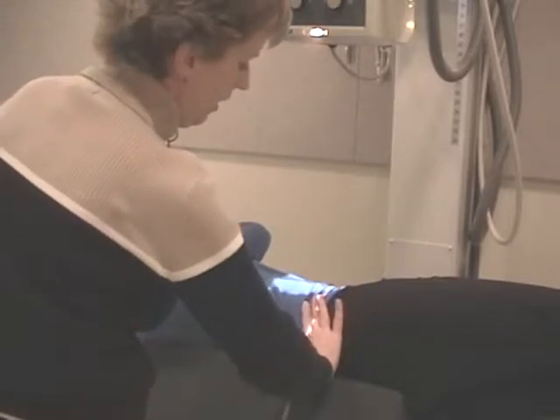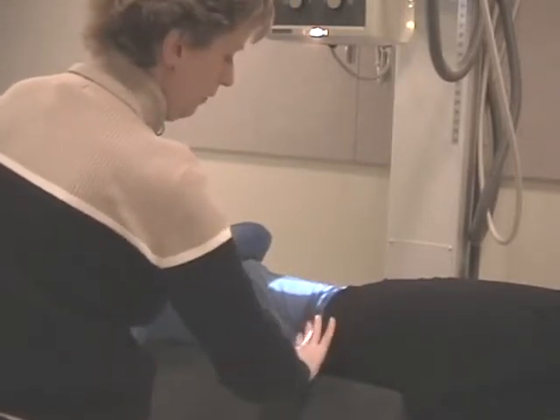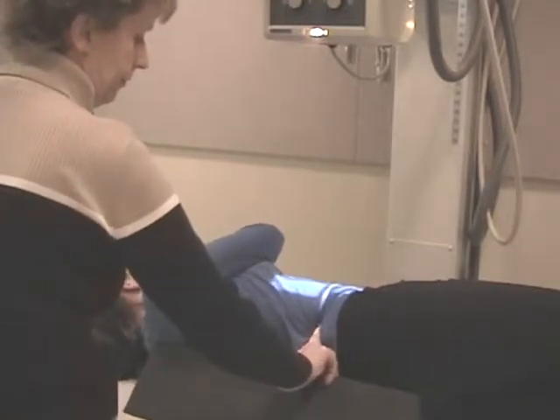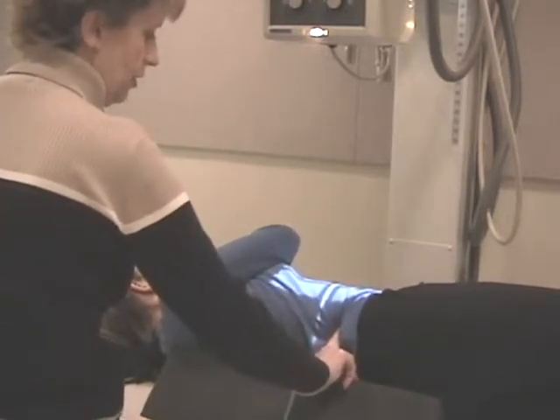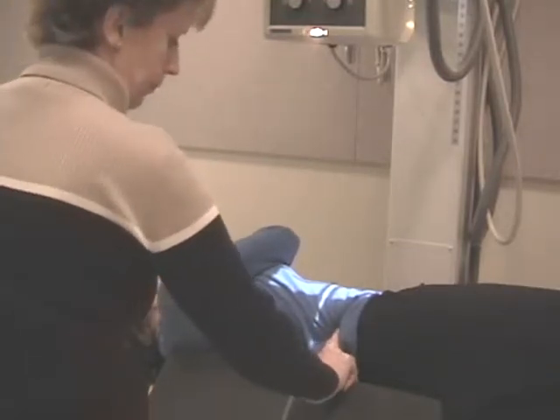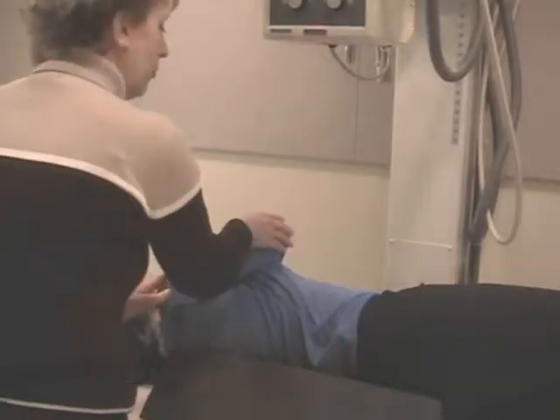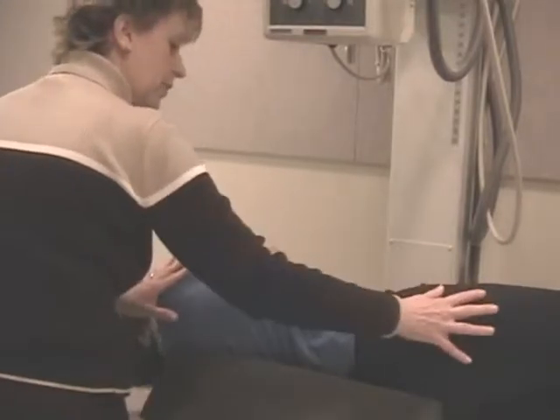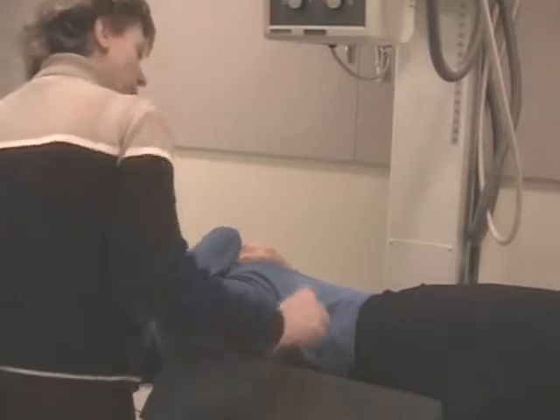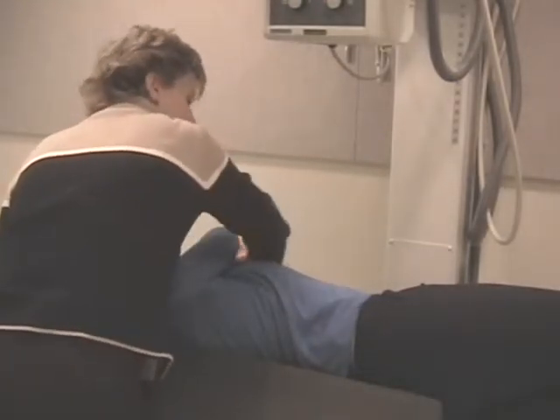Find the iliac crest, flat hand, fairly firm, feeling posteriorly. And the center of the film is 2 inches above that point. Okay, make sure the elbow's not in the way. Hips and shoulders are at the same plane. Okay. I'm going to show you a trick that you can use here.